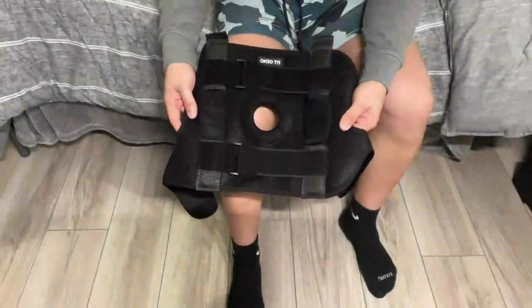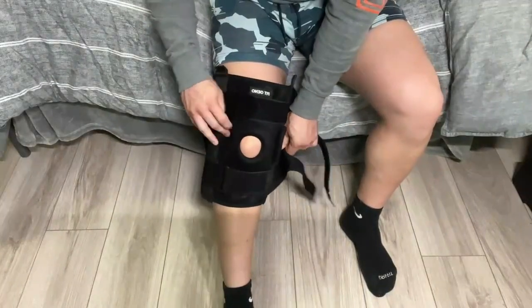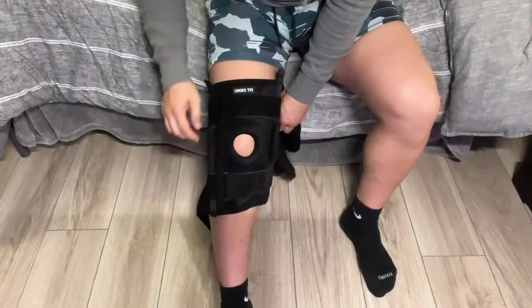I want to show you how to put the brace on. First, you're going to want to wrap the brace snugly around your leg and align the patella opening with your kneecap.